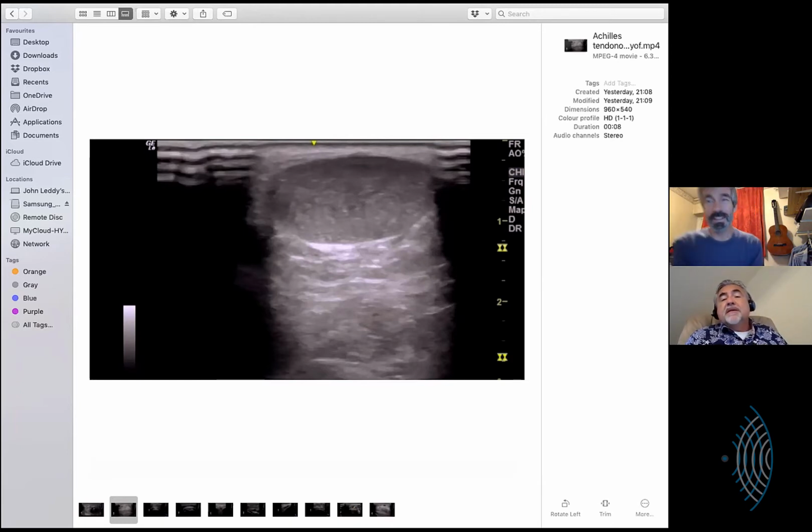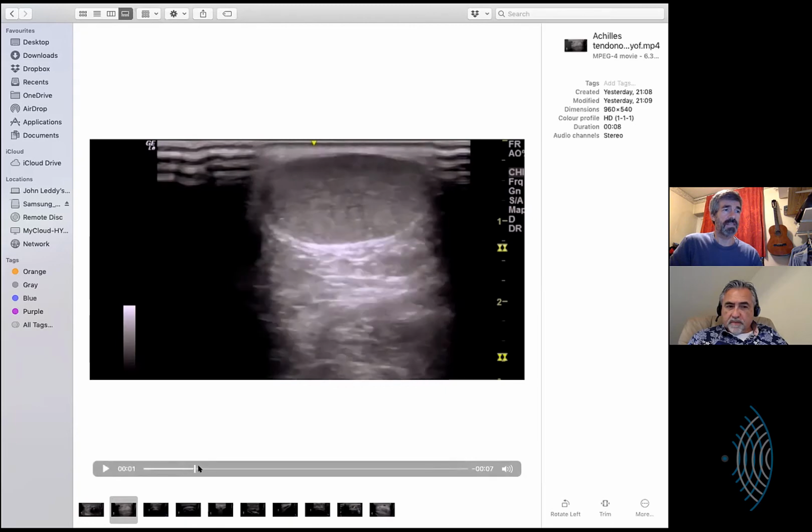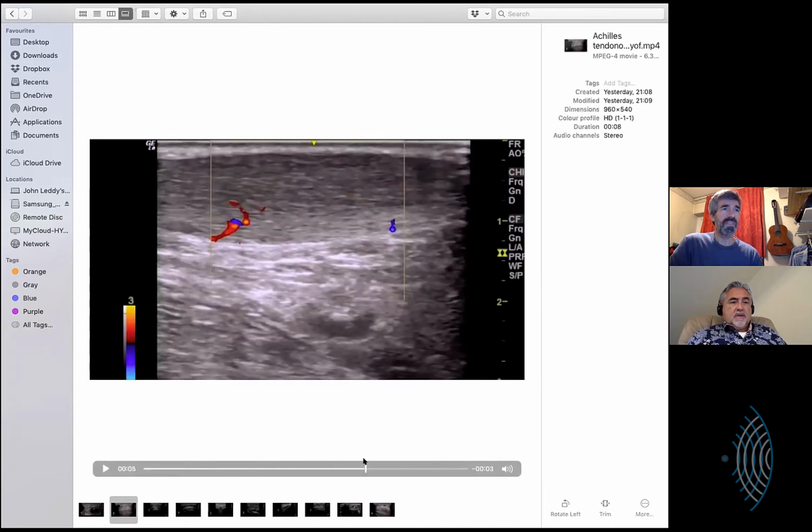Mostly counseling. Probably a slight heel raise. Okay. Take the pressure off. Yeah. You still do some loading, but patients have already failed loading before they get to me. I'm not seeing anything significant. If you look at the color flow in something like this, there's not a lot of that. The soft tissues underneath are not particularly abnormal.